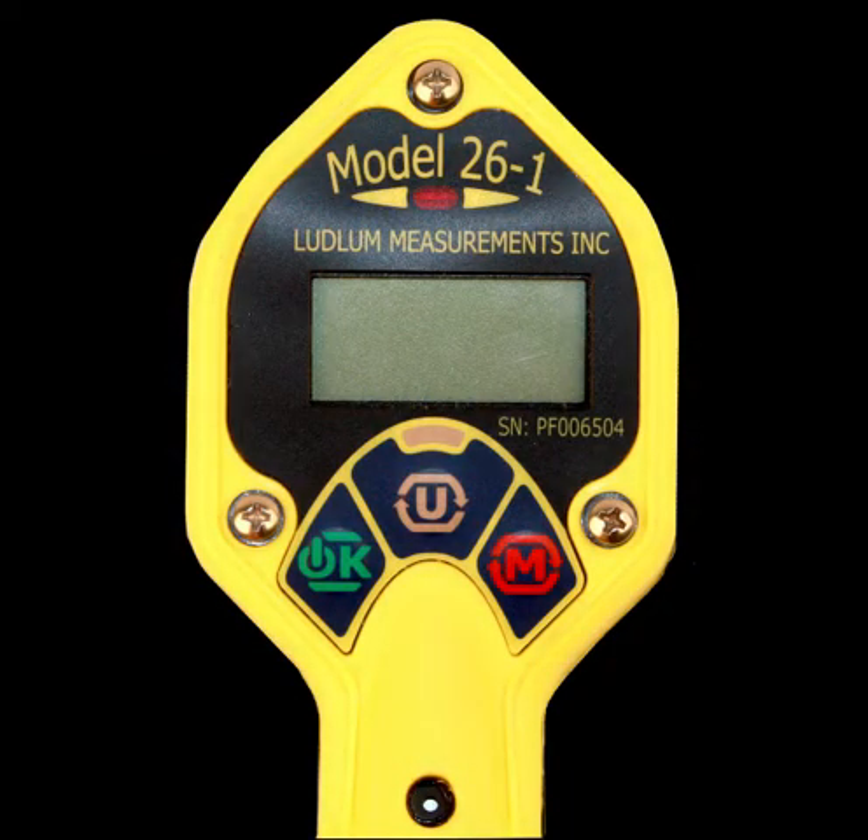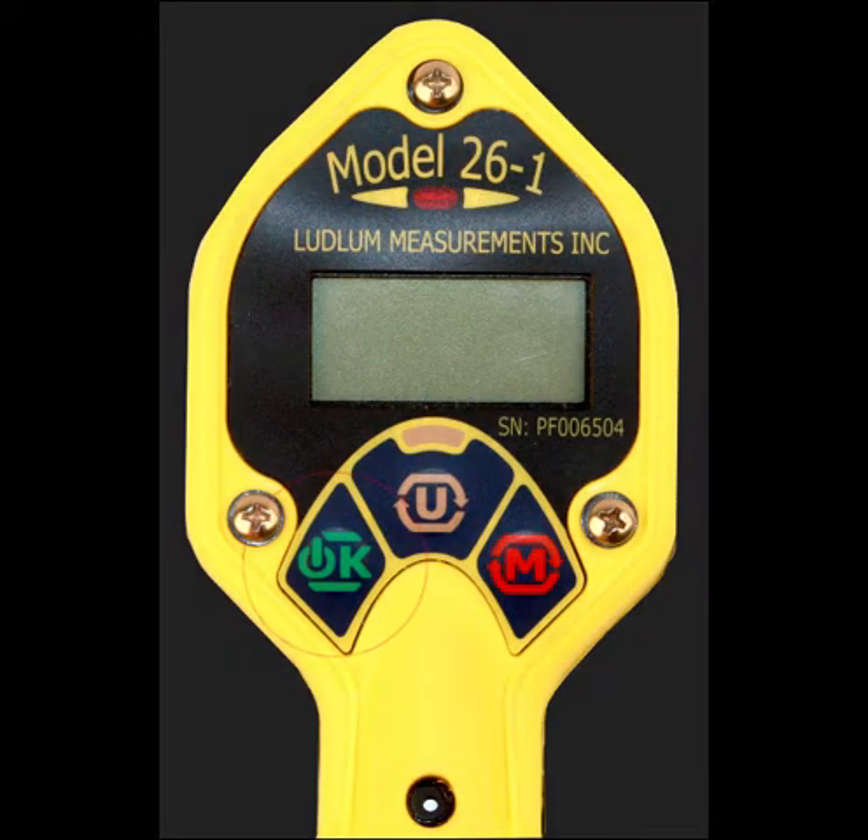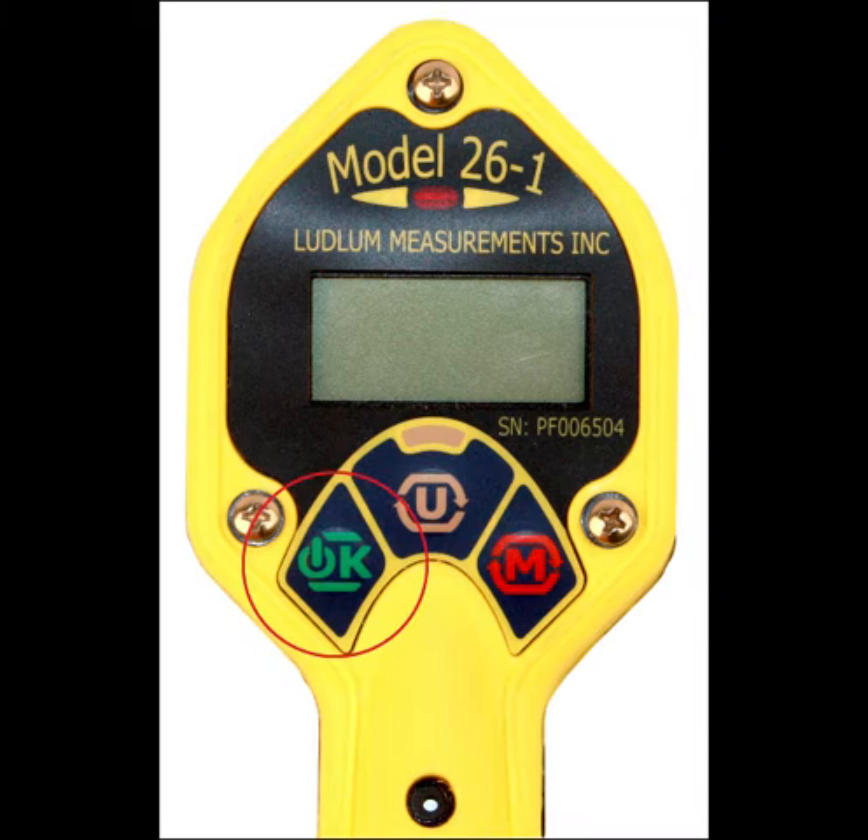The Model 26-1 has three operational buttons on the front of the instrument. The first button is the OK button, which has multiple uses: it is used to power the instrument on and off, silence the click audio, reset the max mode, start or reset the count timer, and to acknowledge audio alarms.